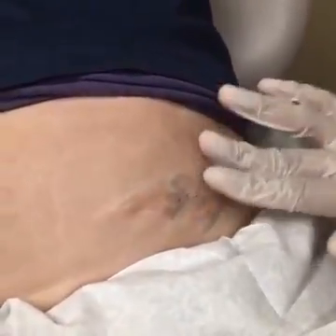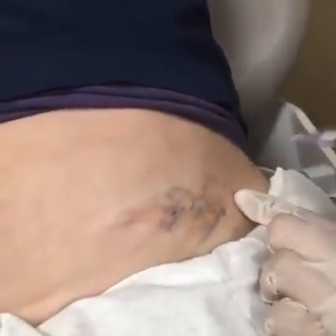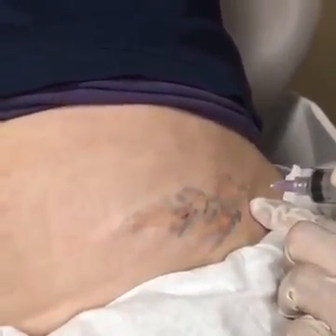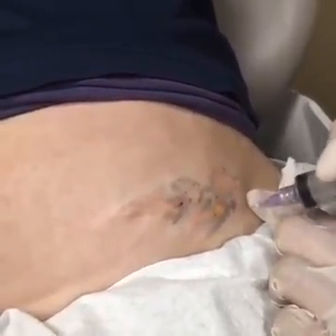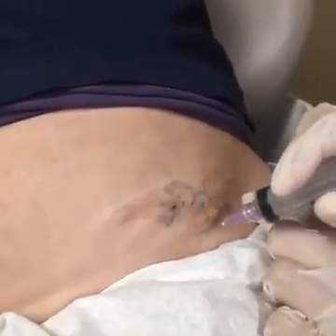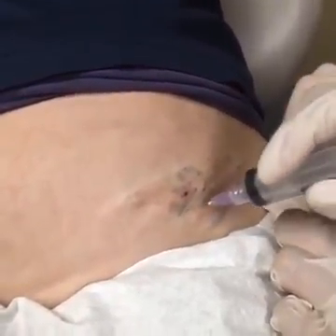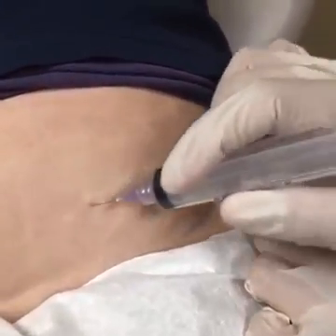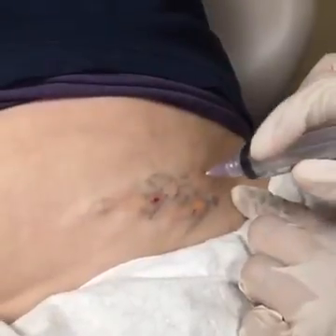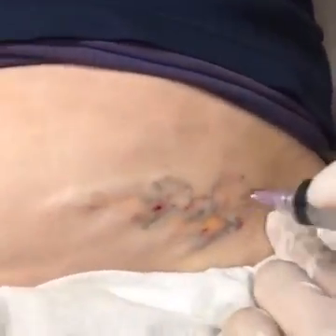So I think now what you're seeing is Alondra testing her to make sure she is numb all the way around her tattoo. So if you want to just tell us if you feel anything sharp, we'll add some more numbing medicine. But right now she's just checking to make sure she's numb. And our patient says she's not feeling that, all seems really numb. And so even though that may look like it's hurting to y'all, it's not hurting our patient, which is perfect because we don't want her to be in pain.